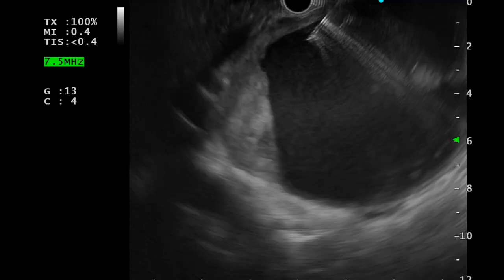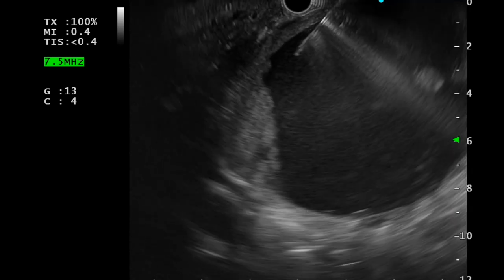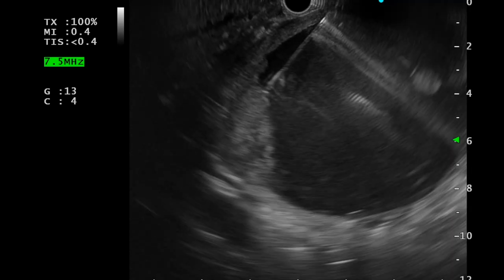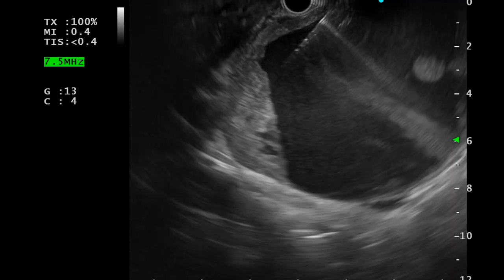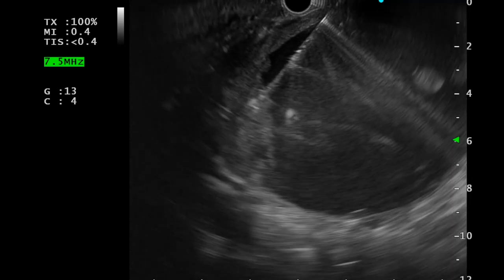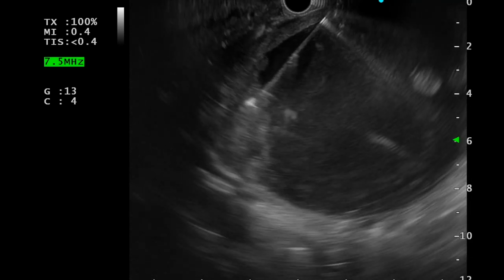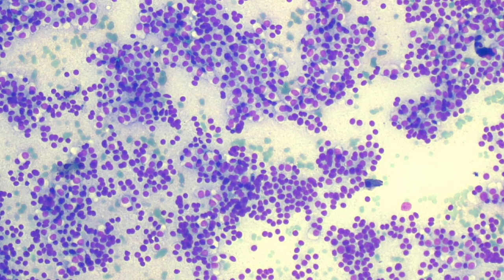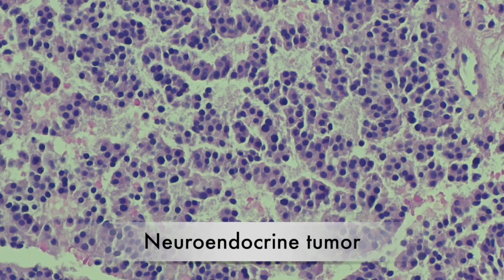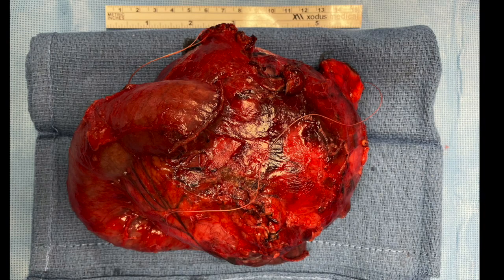EUS-guided fine needle aspiration of this area of cystic wall was performed. The final diagnosis was a neuroendocrine tumour. The patient subsequently underwent surgical resection.